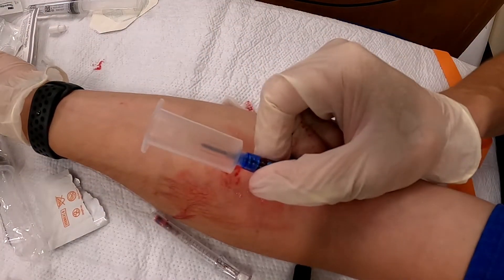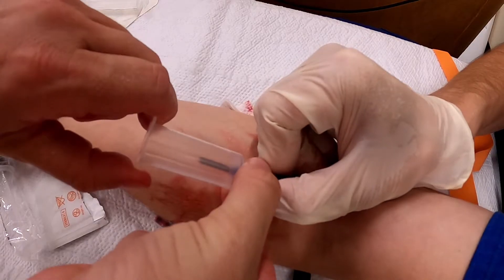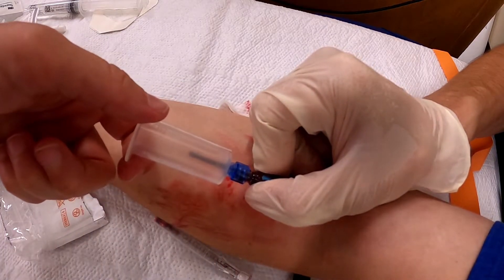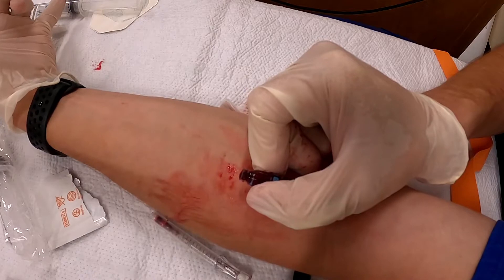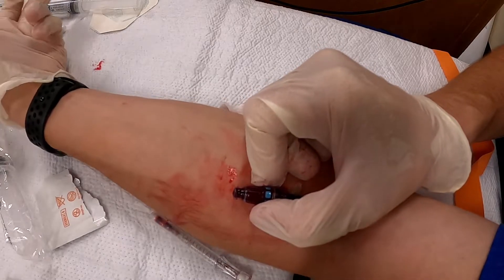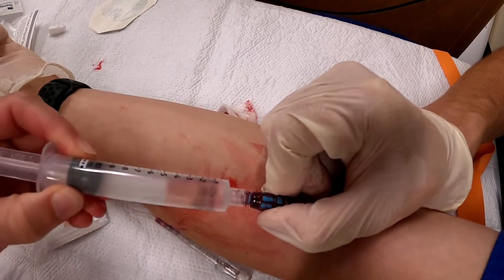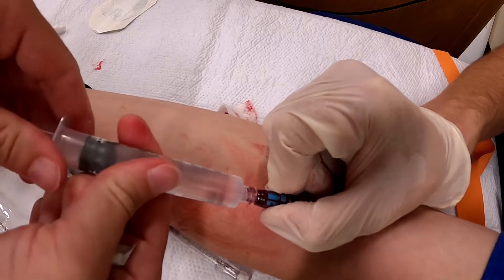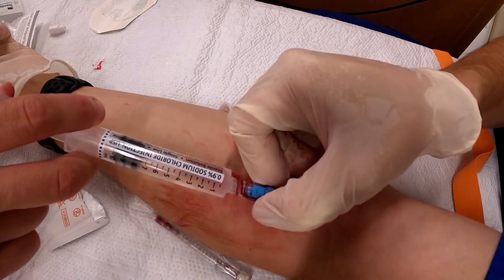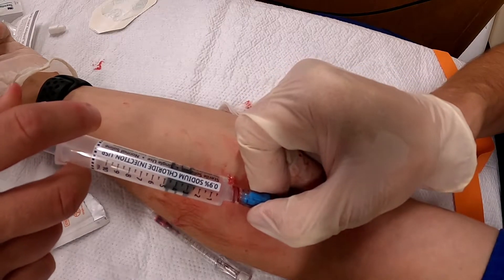Spin that clave off — there we go. It's not pretty, but you got it. You ready? There's the flush right there. A little bit more pressure. Okay, I'm gonna relax — go ahead, you're good. Just an IV flush. Good deal — I'll hold it, you can spin it off.